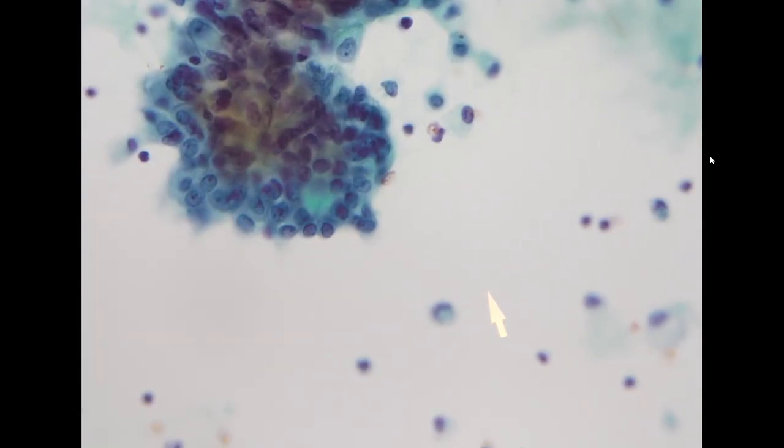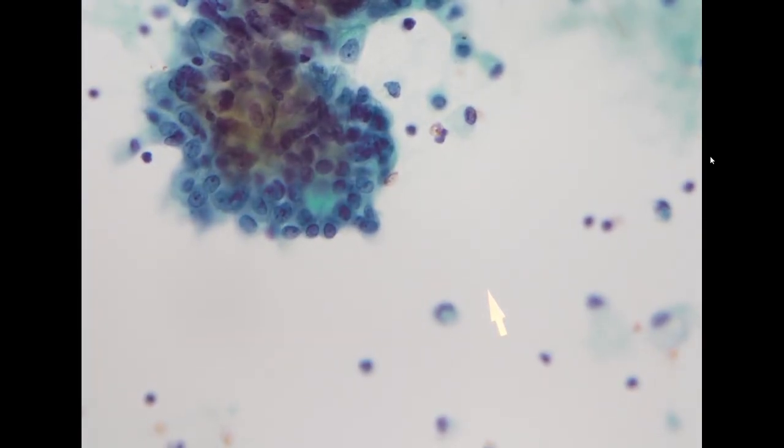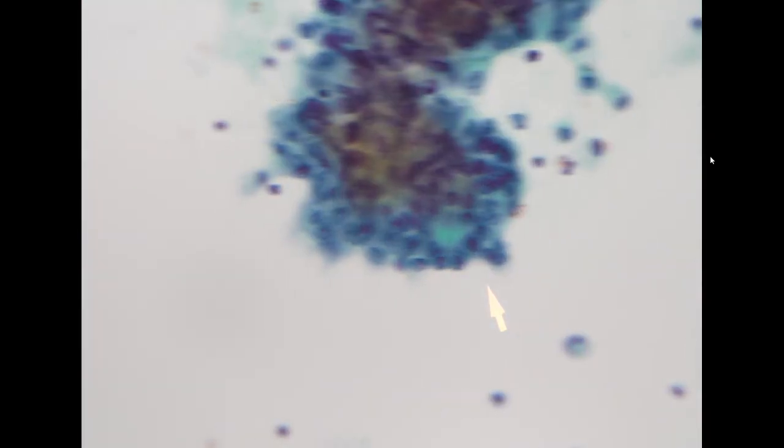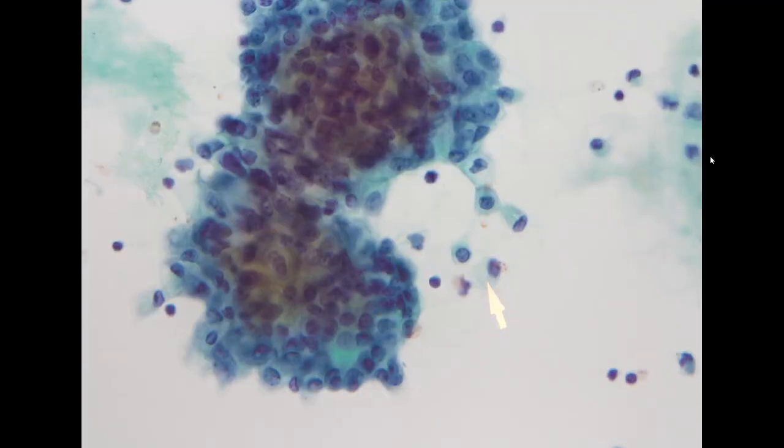Sometimes in severe cirrhosis patients, you will see ascites presenting with these multiple cell clusters, and it is uncertain if this is carcinoma.